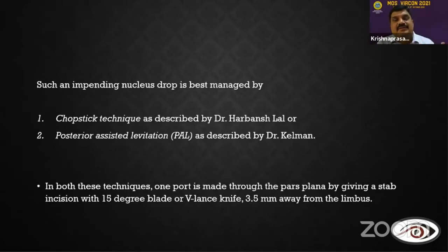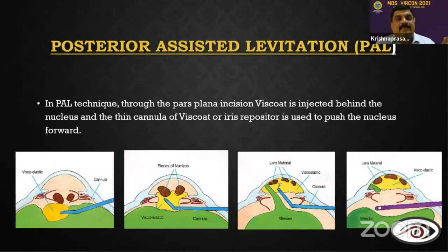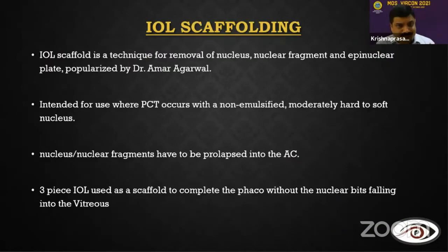One is the chopstick technique described by our friend, Dr. Harbans Lal, or PAL, that is posterior assisted levitation by Dr. Kelman. In PAL, through the pars plana, viscoelastic is injected, and with the help of a 26 gauge needle or thin cannula, the nucleus is pushed forwards.